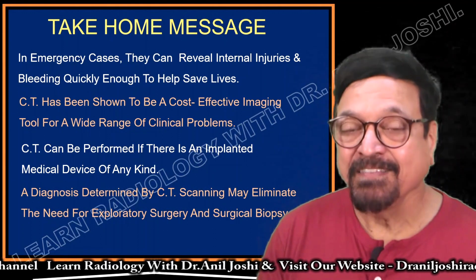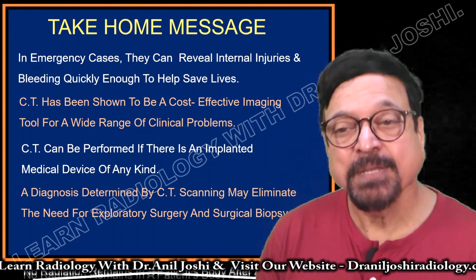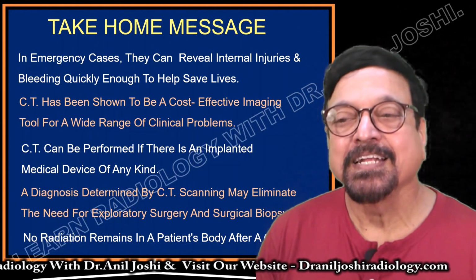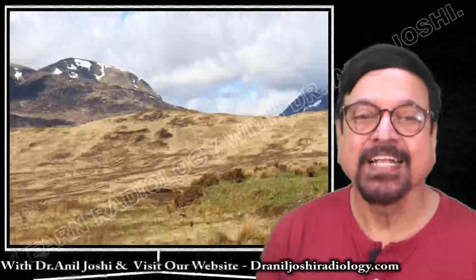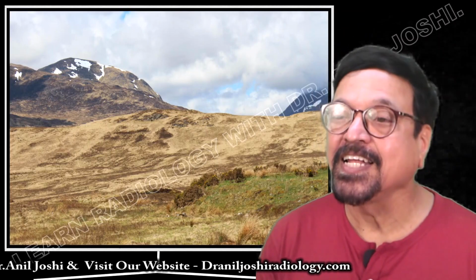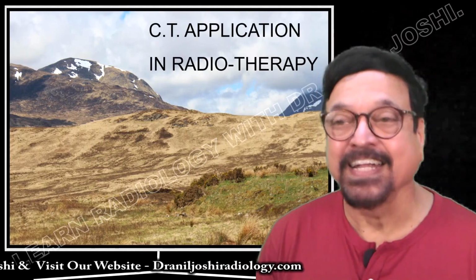We have seen with dual source energy how even in these patients we can get the best possible images. And no radiation remains in the body after the CT examination is over. Once you complete the examination and leave the department, the radiation is left there itself. It doesn't come with you and it doesn't get retained.